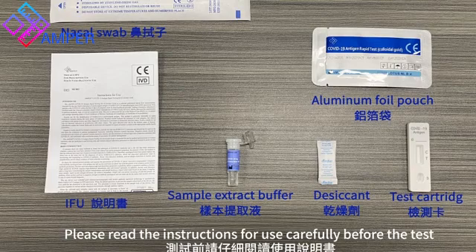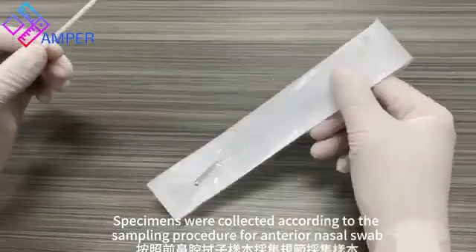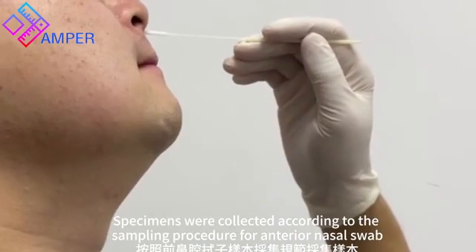Please read the instructions for use carefully before the test. Specimens were collected according to the sampling procedure for anterior nasal swab.